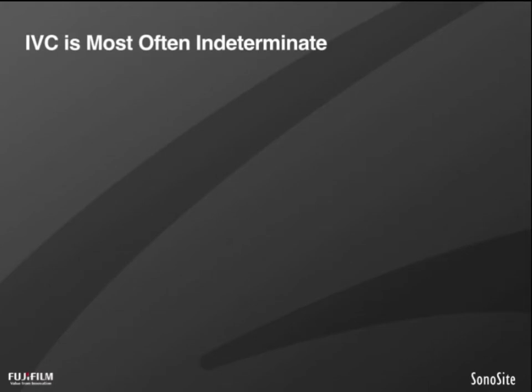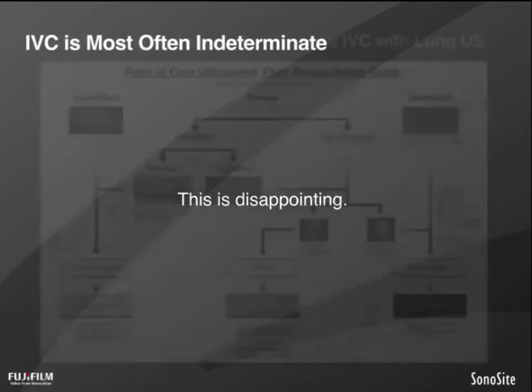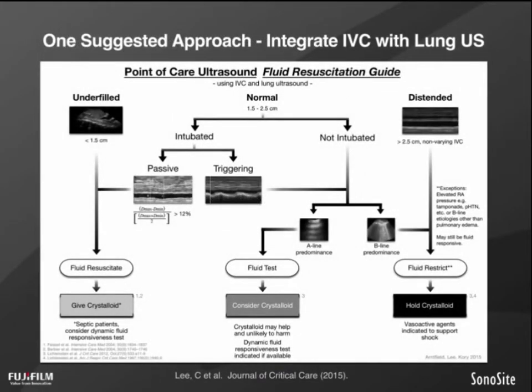So I'm just going to say that in my experience, the IVC is most often indeterminate. At the extremes, it may provide a signal. This is undoubtedly disappointing. We were hopeful that the IVC would be able to provide us with a single shot window into the body's volume status and give us very accurate and safe information about how to load patients with volume. We have just published a multi-system approach to addressing this disappointment. I'll leave this on the screen to consider, and you can check out the reference.